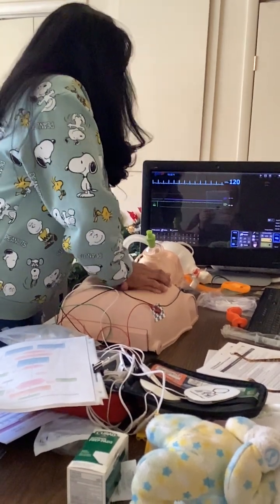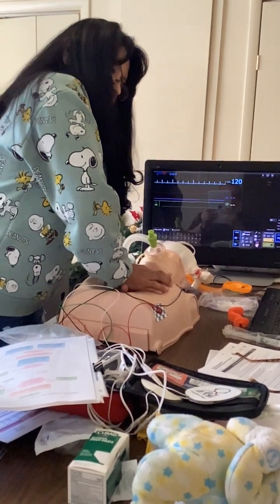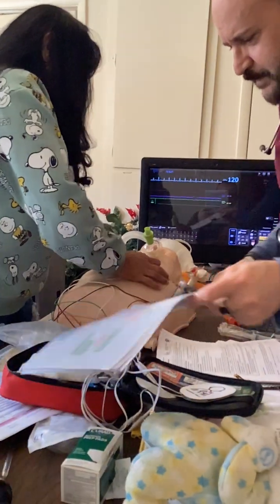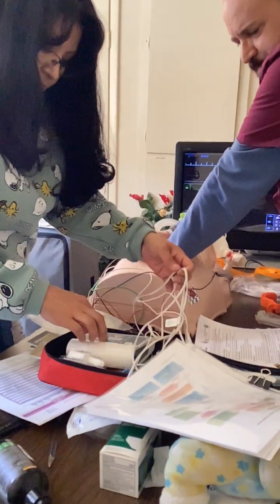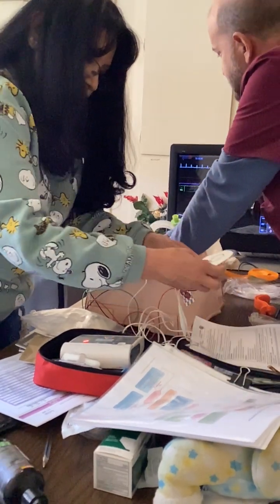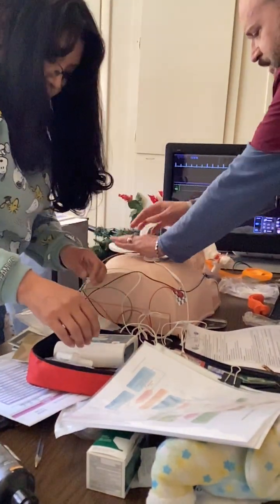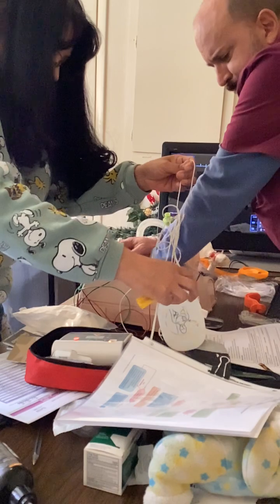Okay. 3, 4, 5, 6, 7, 8, 9, 10, 11, 12, 13, 14, 15, 16, 17, 18, 19, 20, 21, 22, 23, 24, 25, 26, 27, 28, 29, 30. Okay. AED's here. Do what you need to do with it. I'm gonna put the AED in. Apply pads to patient's bare chest. Plug in pads connector next to flashing light. Apply pads. Plug in connector.